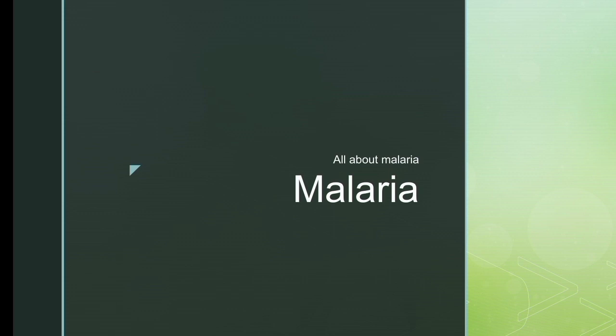We are learning about malaria today. In this topic, we discuss its life cycle, symptoms, and how malaria is diagnosed on thick smear and thin smear.